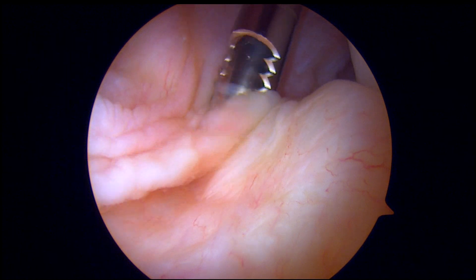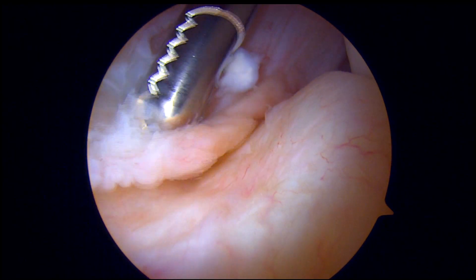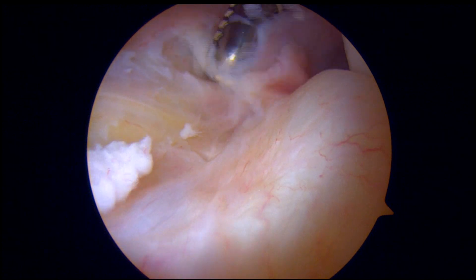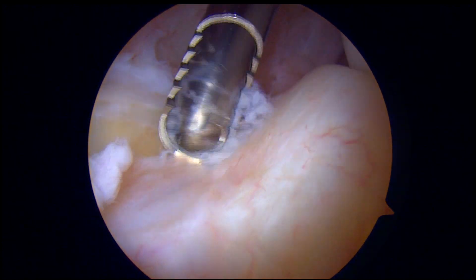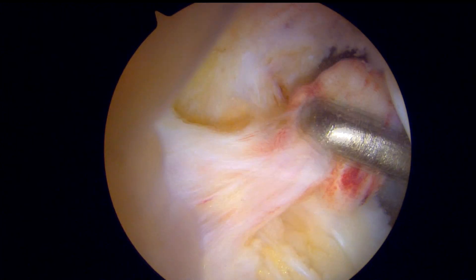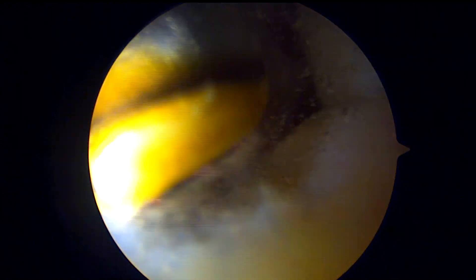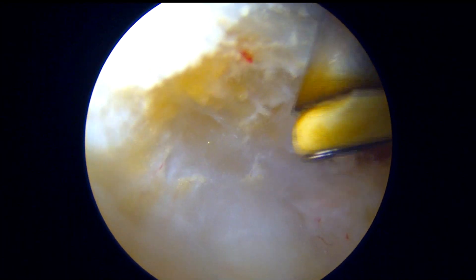The posterior medial aspect of the knee is now visualized, and we are using an arthroscopic shaver. Here we can see more cartilaginous loose bodies — including a hardened piece of synovial chondromatosis loose body that is removed with the grasper — and the arthroscopic ArthroCare wand is used to ablate the synovial tissue.